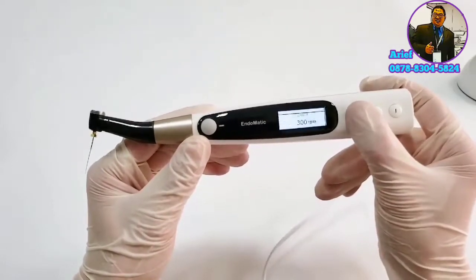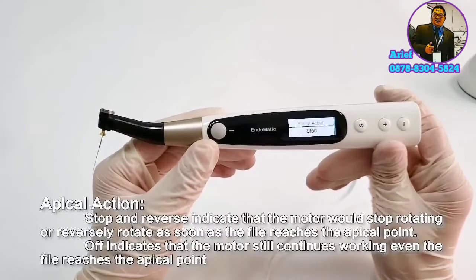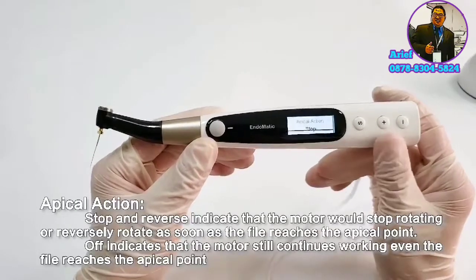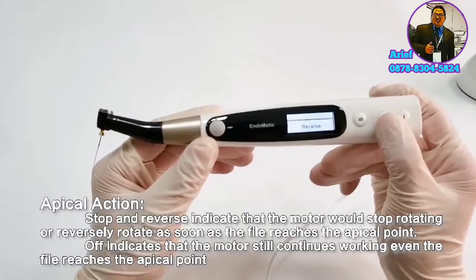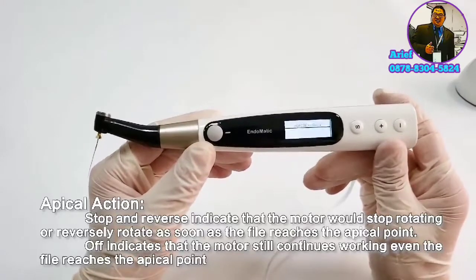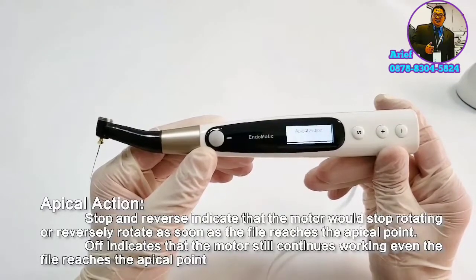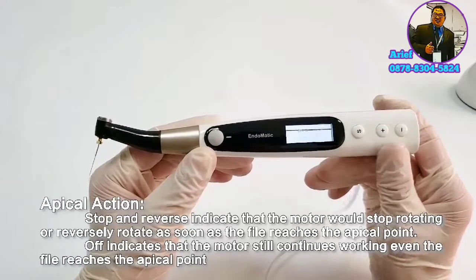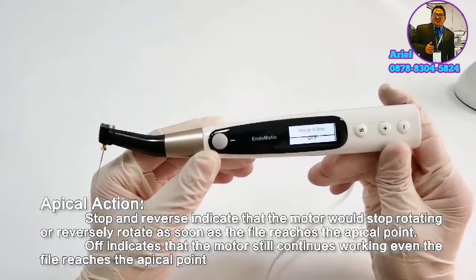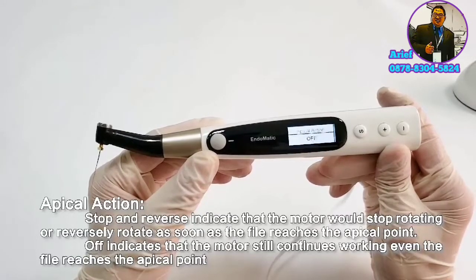Now let's look at some small functions. Press the S button and switch to apical action setting mode. It includes stop, reverse, and off — three modes. Stop and reverse mean the motor stops or reverses rotation when the file reaches the apical point to prevent perforation.